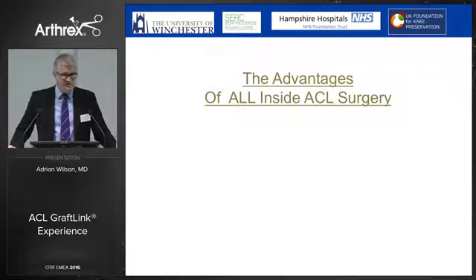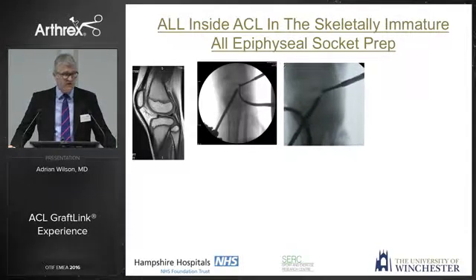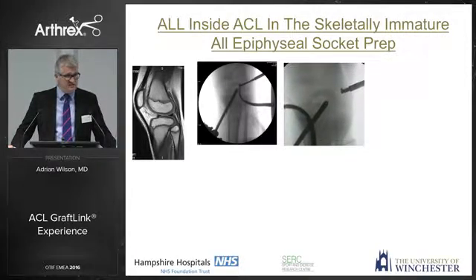There are many advantages to this particular surgical procedure. We get a lot of paediatric referrals, and we use an all-epiphyseal technique wherever possible, and in fact we use parental donor tissue now in the small Tanner 1 and Tanner 2 children who are going for a formal reconstruction. And it's very easy to use the flip cutter, particularly with the paediatric guides, to stay below the physis.